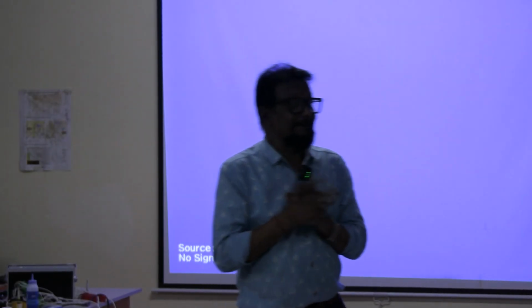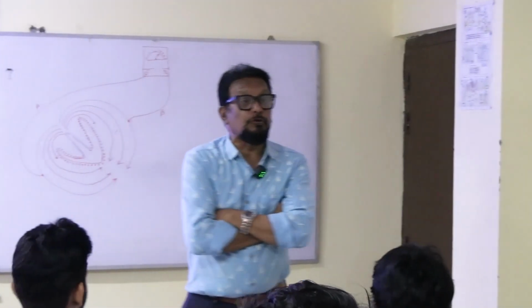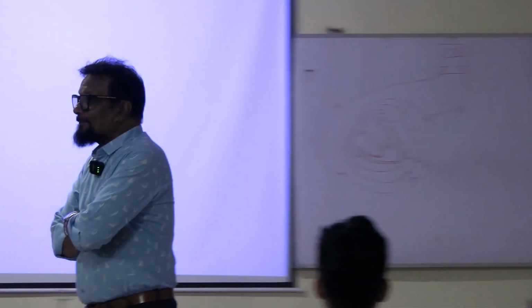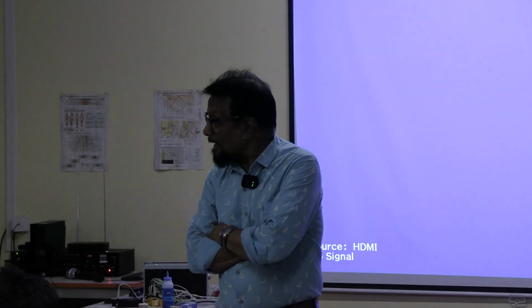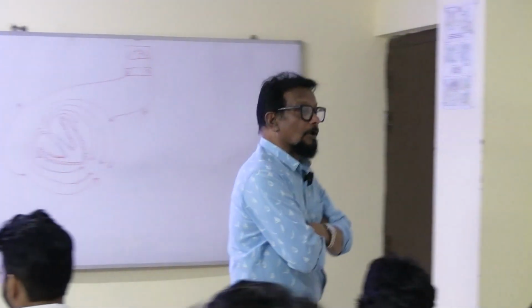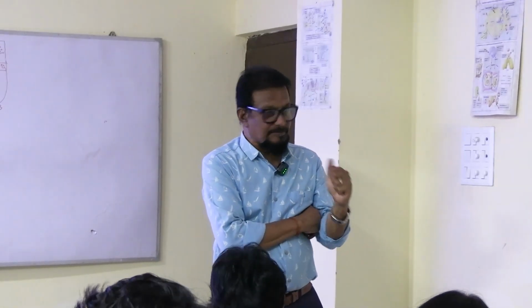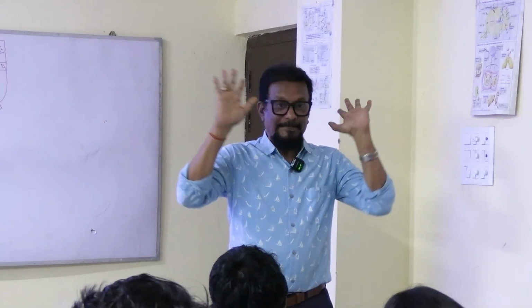Okay. Now another lead system is there. These are called precordial leads, also called chest leads. These chest leads are also unipolar leads. In the unipolar chest leads, all the negative poles are together and are called the reference electrode, and there is one exploring electrode.